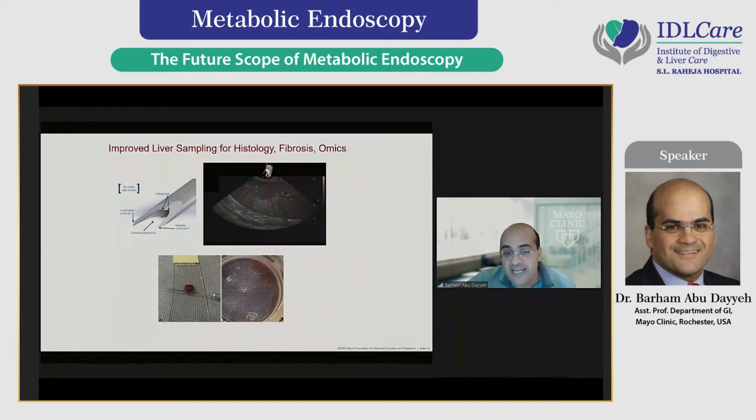The second improvement is the ability to widely sample the liver for metabolic disease with endoscopic ultrasound. And here we show that we took enough sample using a core cutting needle in order to perform lipidomic analysis. And you could see the quantity of cells that we do.